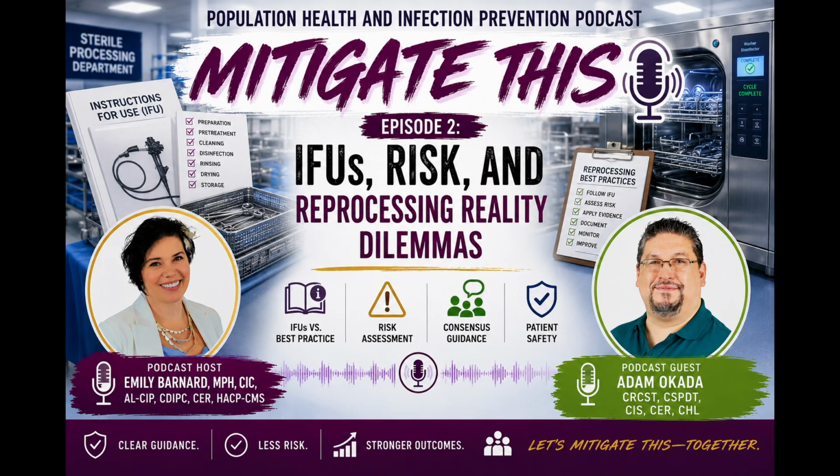Thank you for bringing up AAMI guidelines as a way to help bridge the gap between conflicting IFUs, especially with complex devices like lumen endoscopes or shavers, where the margin of error gets very small very fast. From the infection prevention side, we naturally start thinking in terms of risk assessments and process variability. What happens when one IFU calls for additional flushing or soaking steps?